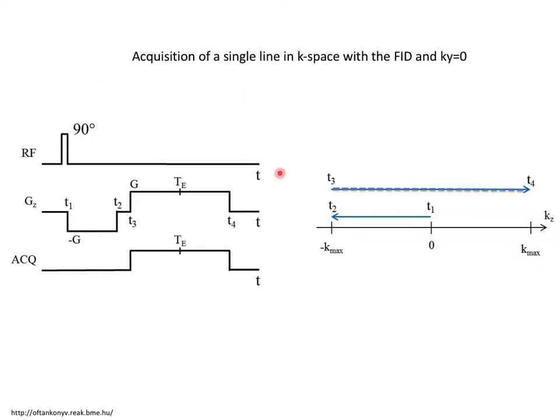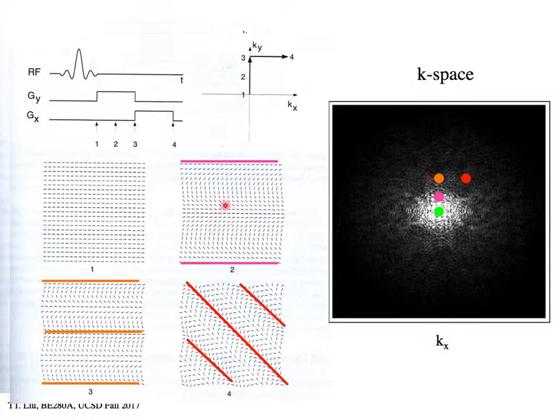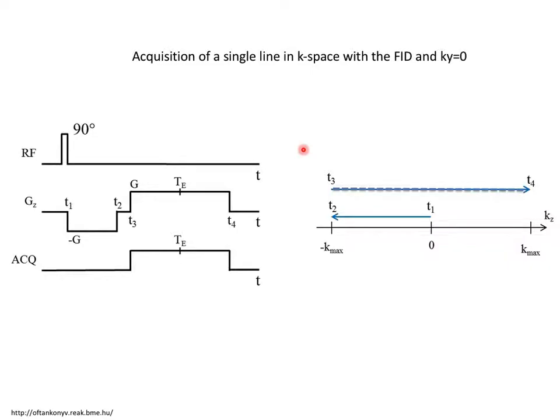So an acquisition of a k-space line, so those were k-space points that we acquired at each one of these times. That's s of t at each point. What we're going to look at is if we turn on a gradient as a function of time and sample while that gradient is on, we effectively streak across the Fourier space in the direction that is defined by this gradient.